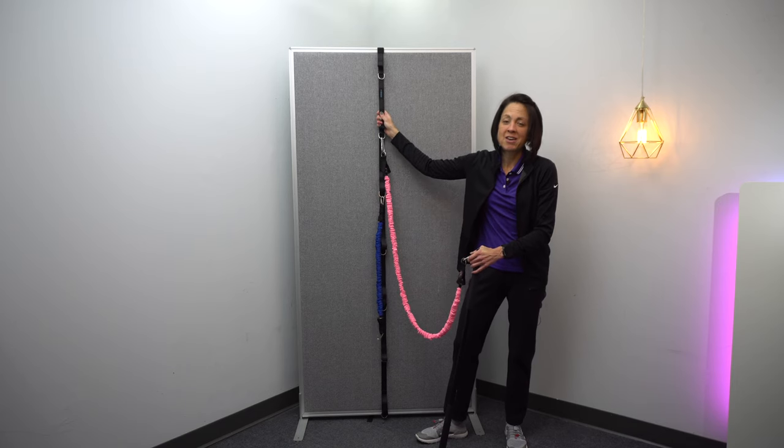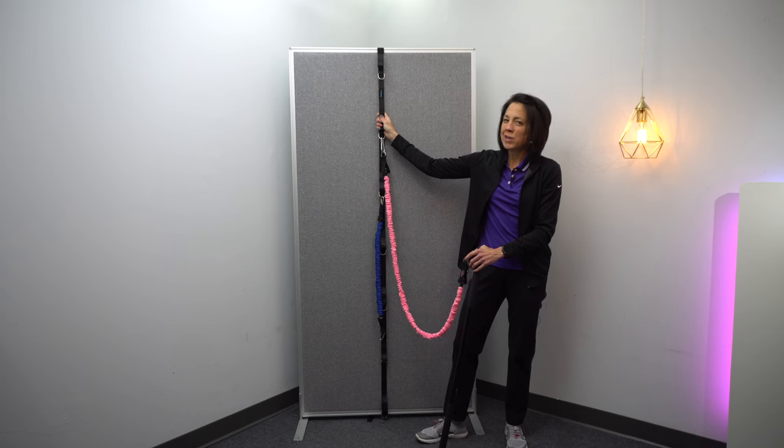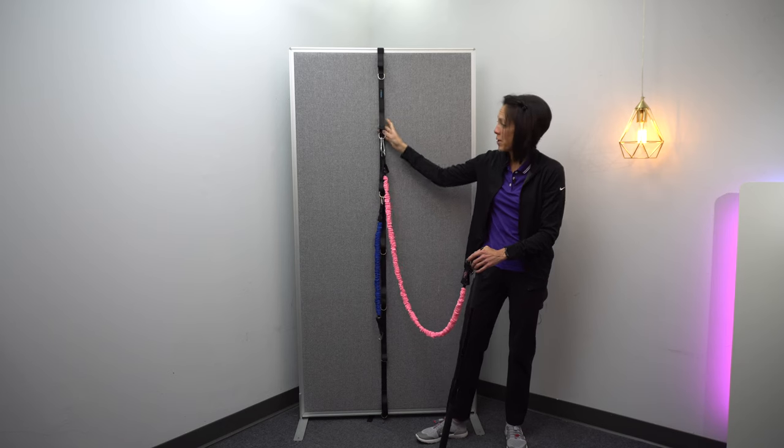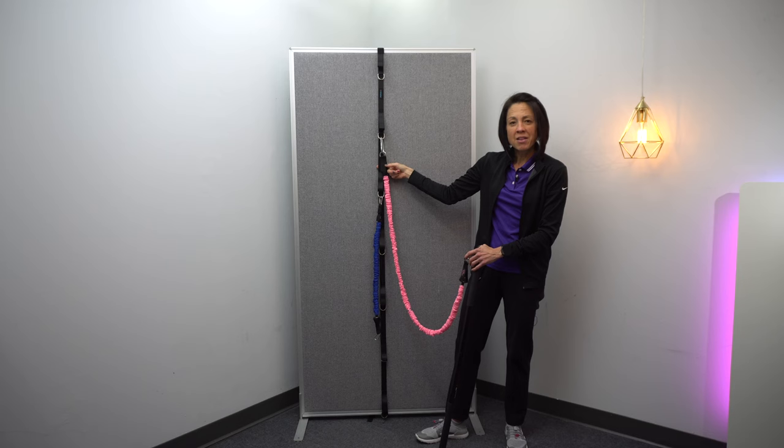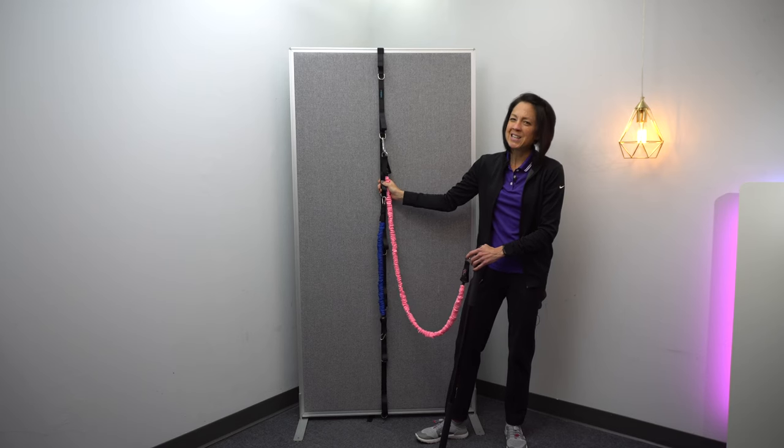I recently came across this product on Amazon and I thought it was a perfect product to test out to see if it really did what it said it did on the Amazon description. Basically this is just like the wall anchor that I use. I saw this and it attaches to a door and I was like, is it really going to be that secure? And it actually really is.